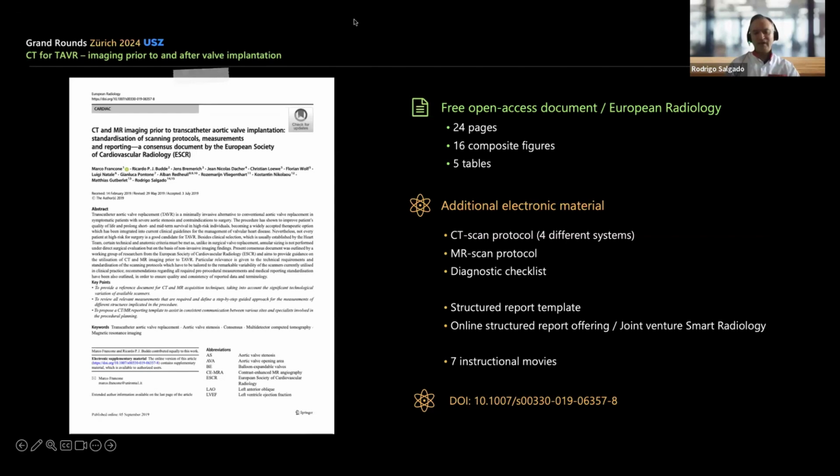So we do look systematically at the coronary arteries, but sometimes, for example, you have extensive calcification, and then it's very difficult to make a firm assessment that this is not obstructive. I think it works for the negative predictive value, but of course not for the positive predictive value. It also depends on the image quality and the scanner that you have. We are lucky to have top-of-the-line CT scanners with mostly very good image quality of the coronary arteries. If your image quality is less, or you have a lower-performance scanner, then it can be difficult. So yes, you have to look systematically, but don't expect a conclusive result in every patient.